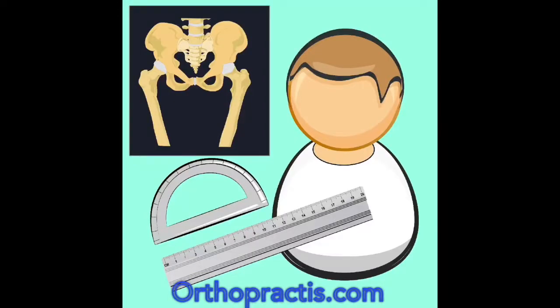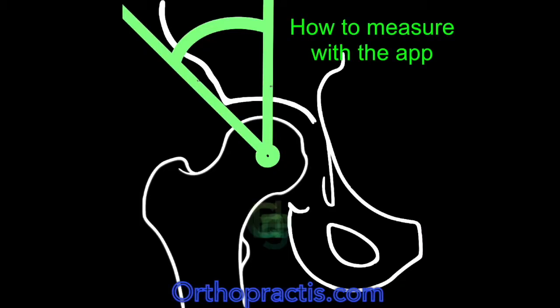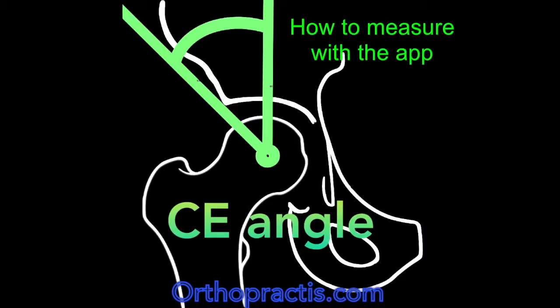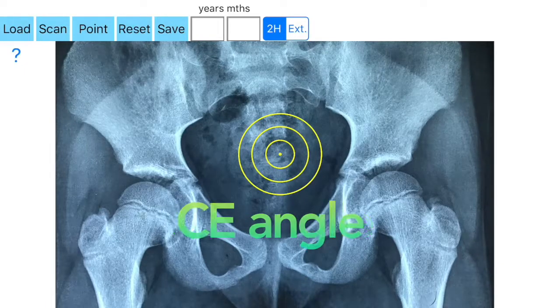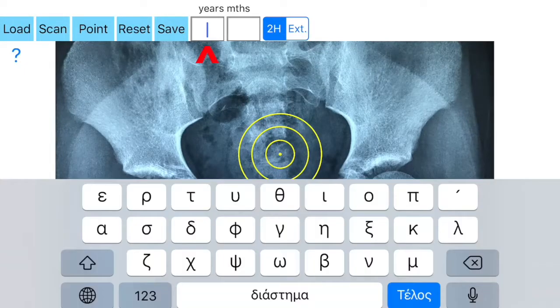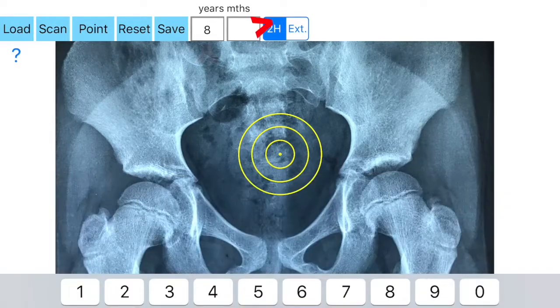This is a tutorial video on how to measure the center edge angle of the hip joint with the app. You load one image of the patient's x-rays, then insert the age of the patient. A circular template appears on the screen in order to determine the points of interest.